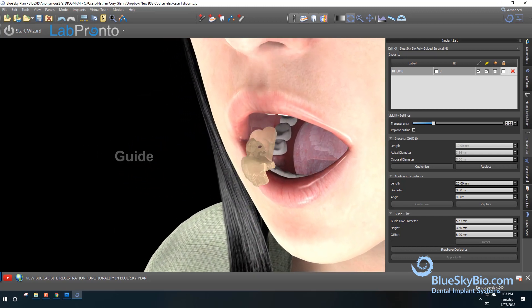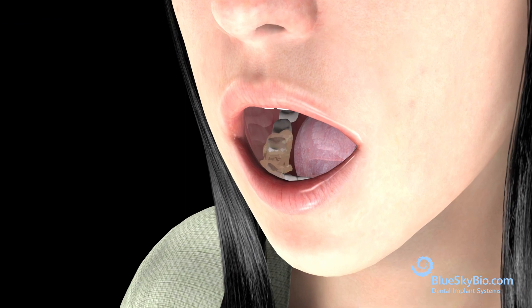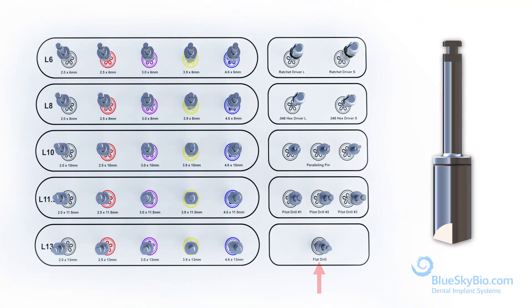The fit of the guide should be verified before the surgical procedure. The drill flat profiler should always be the first drill used in any surgery.